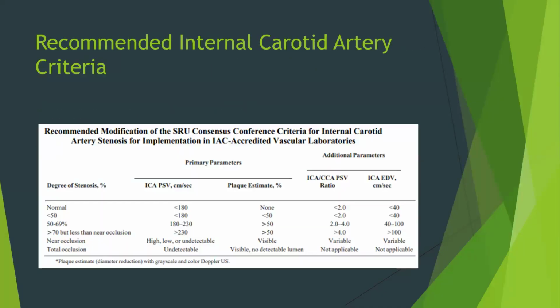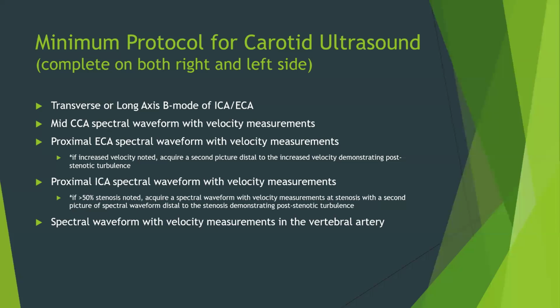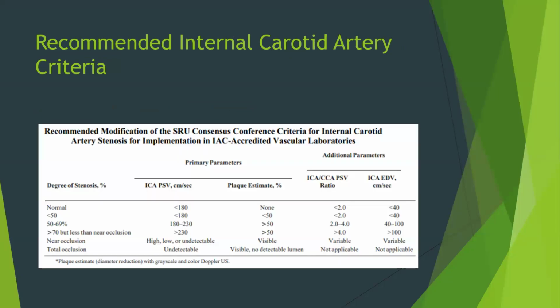So, like I said, this is the updated IAC accredited criteria for internal carotid arteries. So remember, this is internal carotid arteries, not external carotid arteries. This is internal carotid arteries. This is what IAC suggests now to go along with your minimum protocol that I had put up.